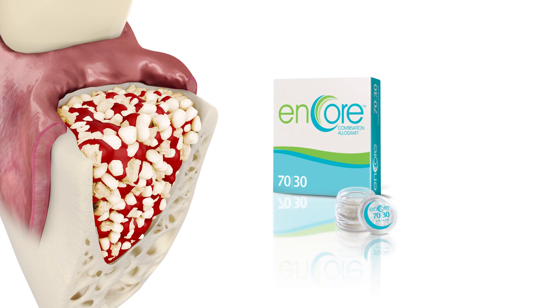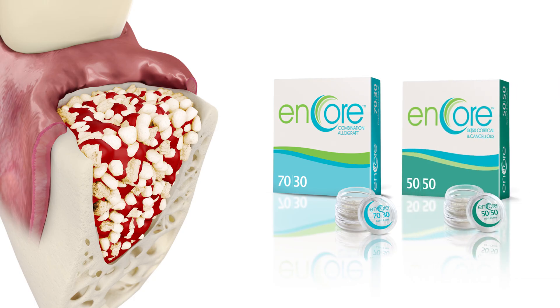At this point, a 70-30 mineralized-demineralized allograft or a 50-50 cortical cancellous allograft is placed. A key to this step is to avoid overpacking the graft particles, as this will impede the ingrowth of new blood vessels. Fill to the crest or just slightly above. Another key step before placement of the membrane is to observe blood flow into the graft to completely surround the particles.